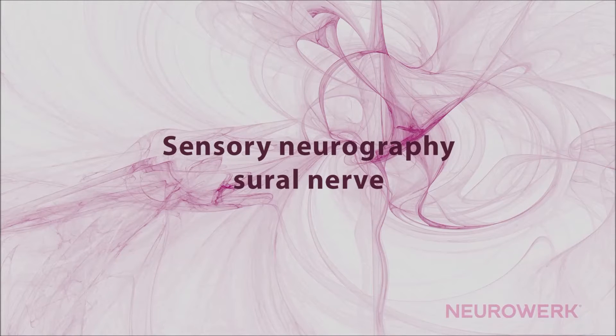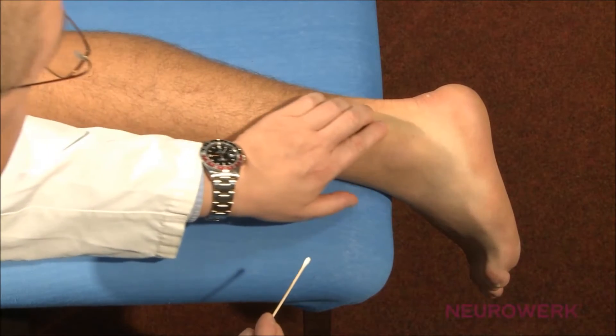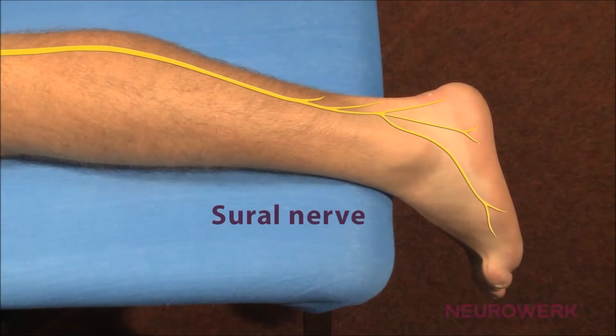Sensory Neurography of the Sural Nerve. The measurement of the sensory nerve conduction velocity on the Sural Nerve is shown here in the antidromic technique. A recording in the orthodromic technique is also possible.